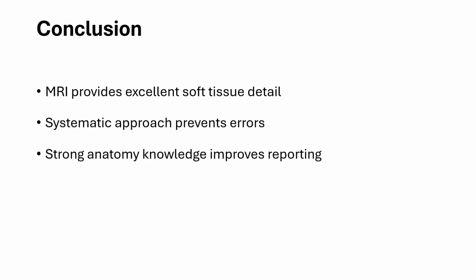Now the conclusion: MRI provides excellent soft tissue detail, a systematic approach prevents error, and strong anatomy knowledge improves reporting.